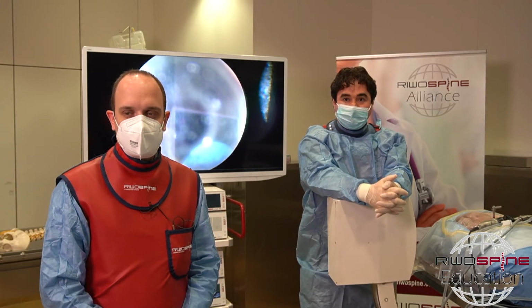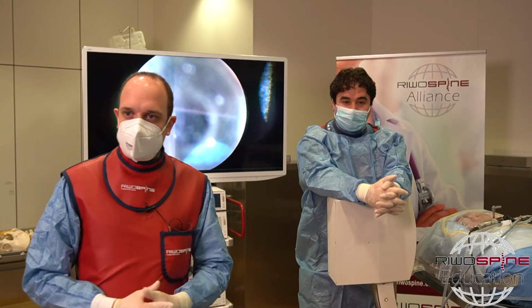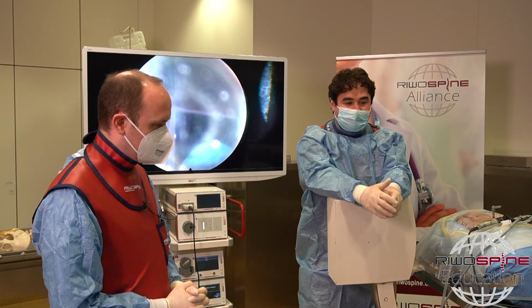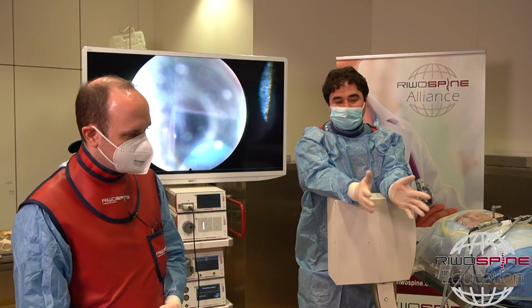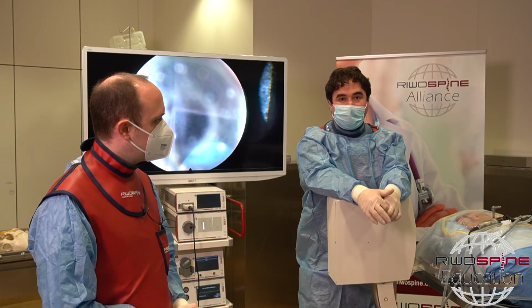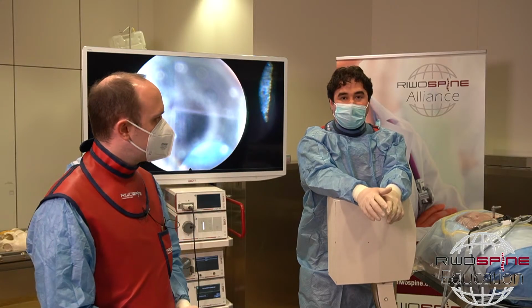Okay, we have another question about the hemostatic technique. For bleedings with the full endoscopic technique, from the epidural area, it's very easy. We just use the coagulation. And the bleeding can be a problem at the beginning from the bone. We have two possibilities to stop these kinds of bleedings.